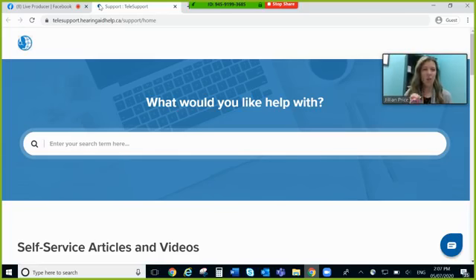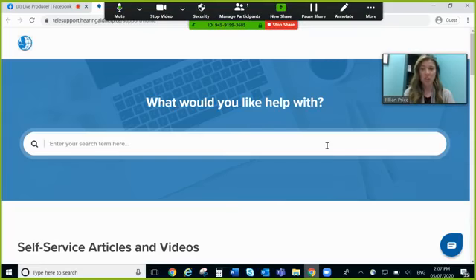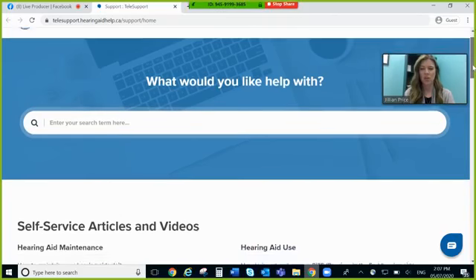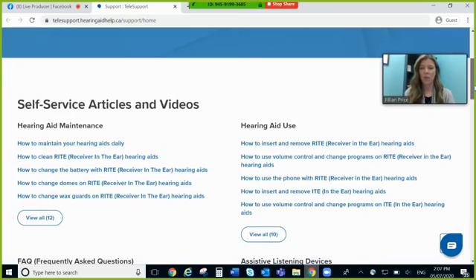So below on Facebook Live, there should be the Telesupport website. So you type that in, which is telesupport.hearingaidhelp.ca, and you're going to come up to this screen. This is the opening screen, and it says, what would you like help with? Which is great. So if you want, you can just start typing something in, and we'll do that in a second, but I'm going to scroll down just so I can show you that if you are not sure or you want some suggestions, there's tons.